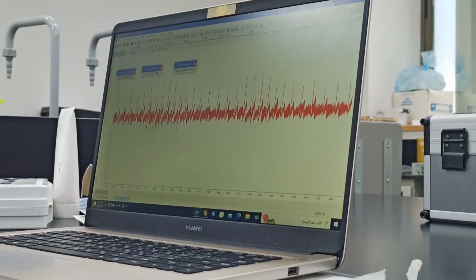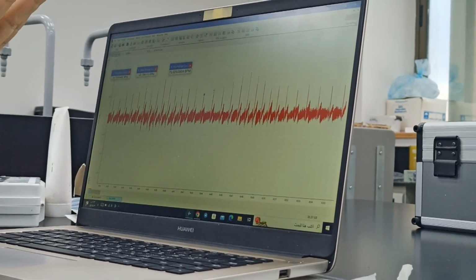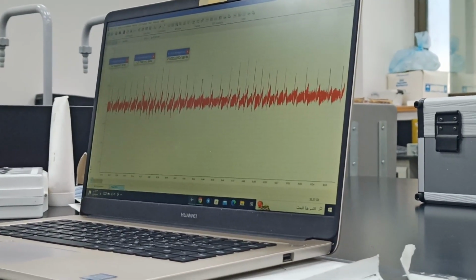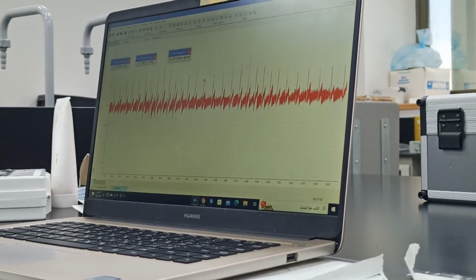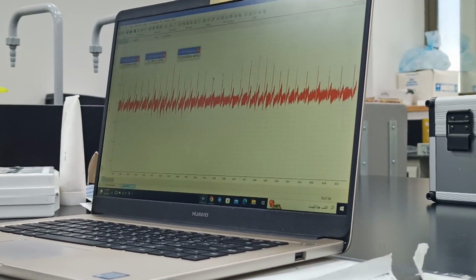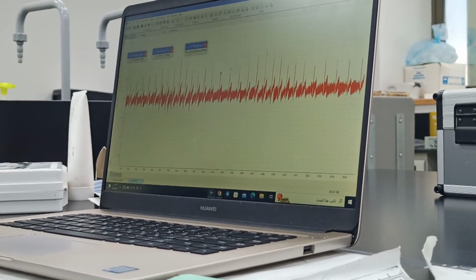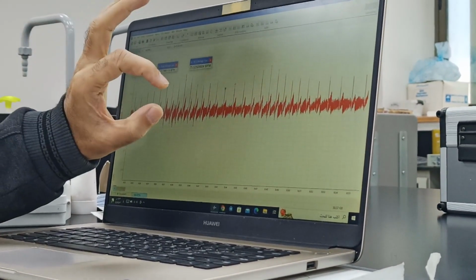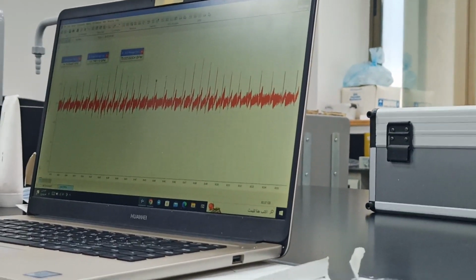Neuropathy, autonomic dysfunction. Okay, and there are so many parameters that are derived from just this RR interval, and you have to be very, very clear in your mind. The most critical point in HRV calculations is that you pick all the peaks properly. All the peaks are detected. All the peaks are there. Because if you miss one peak, the distance between two R waves will be double. All calculations will be wrong. Get my point? Yes. So that's why it is very important that you get a clean ECG record. We did not pay proper attention up till now.